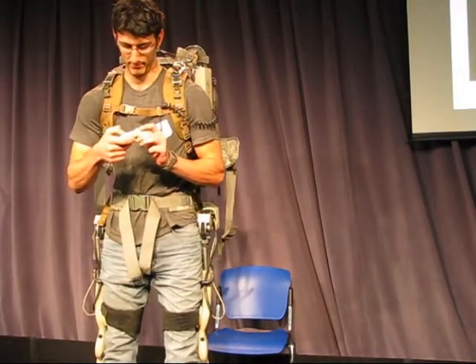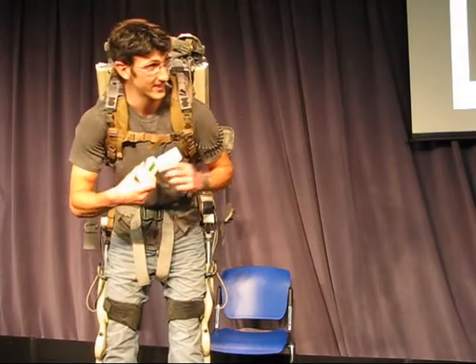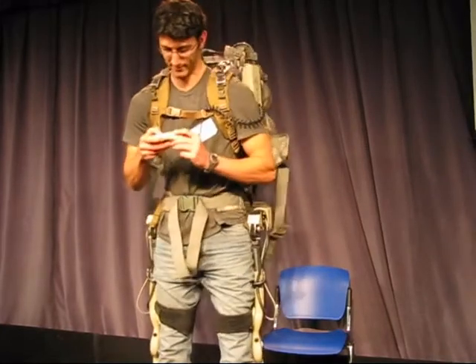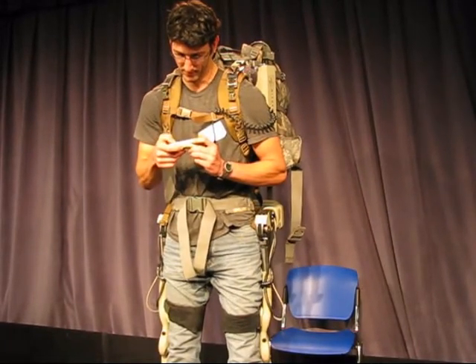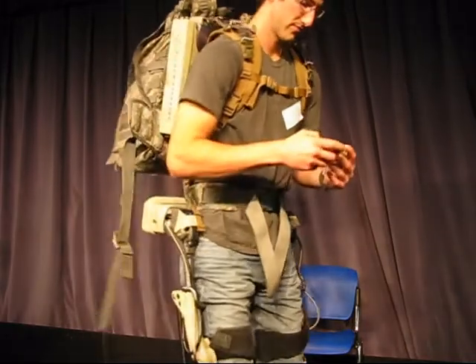Actually finds the center of gravity. Oh, he does. Actually, though, if he bends over, go ahead and try to touch your toes. As soon as he does that, he's actually getting hip torque. The machine basically wants to depower itself when you're close to your neutral CG, so we're not burning a bunch of power. But if he gets into a mode where we think he needs torque, it'll add torque to him.